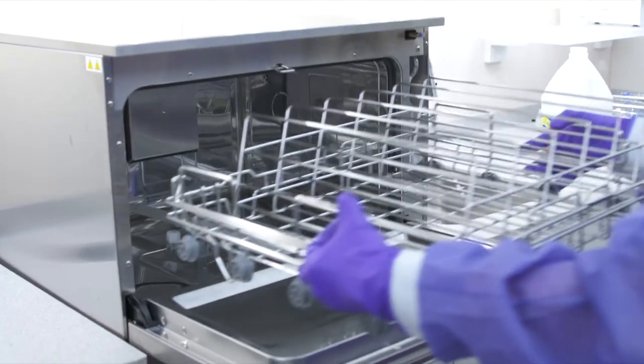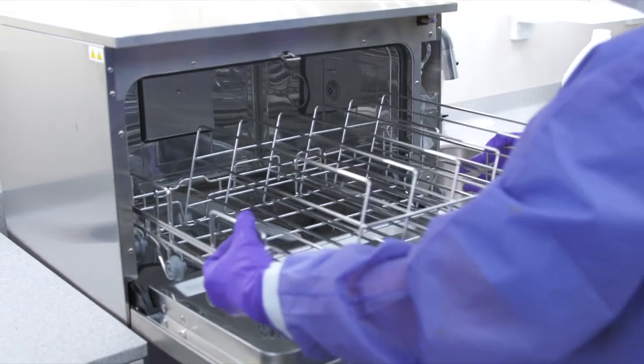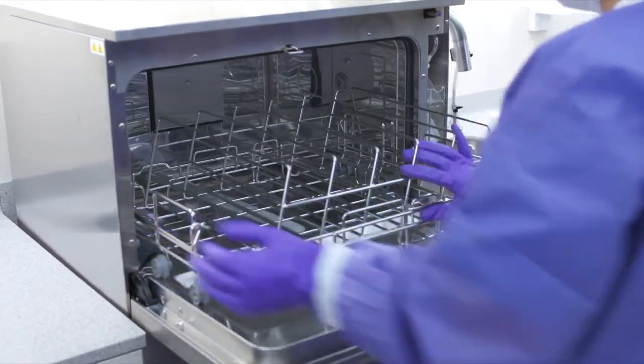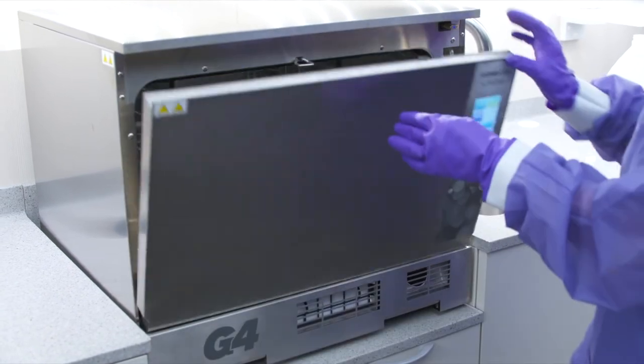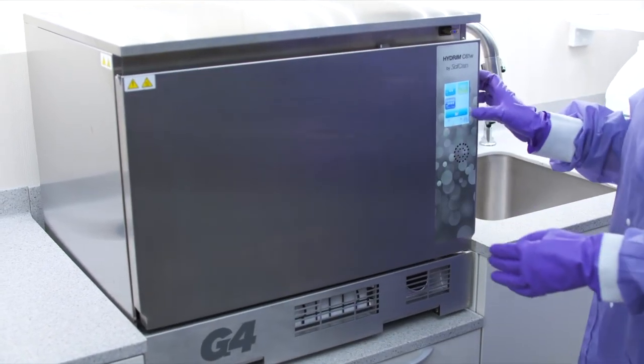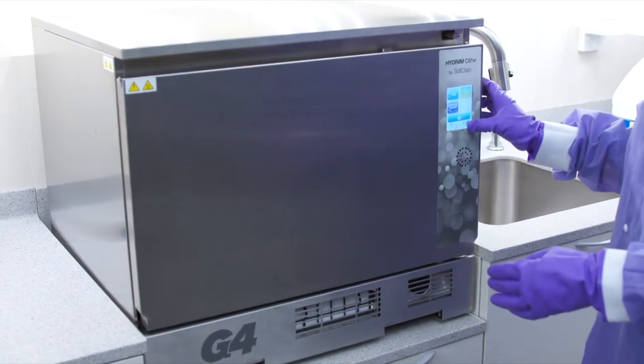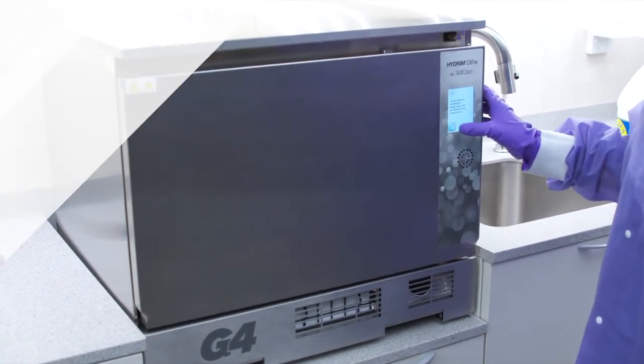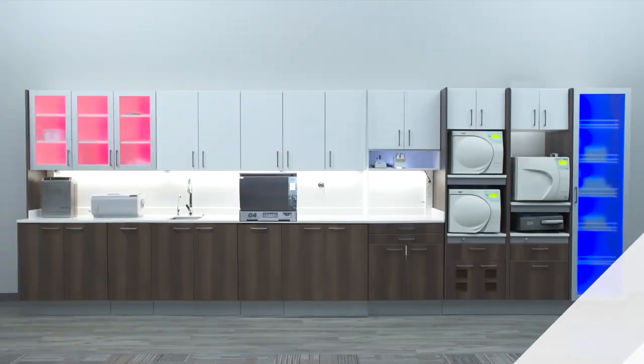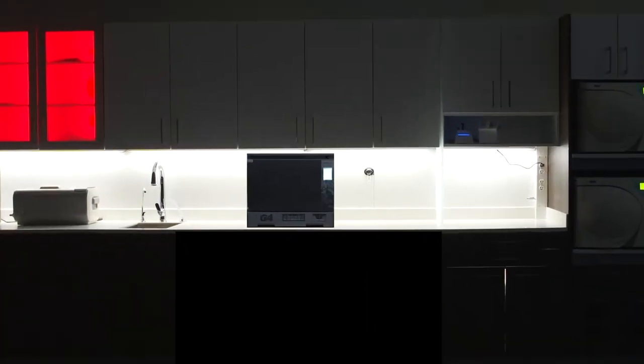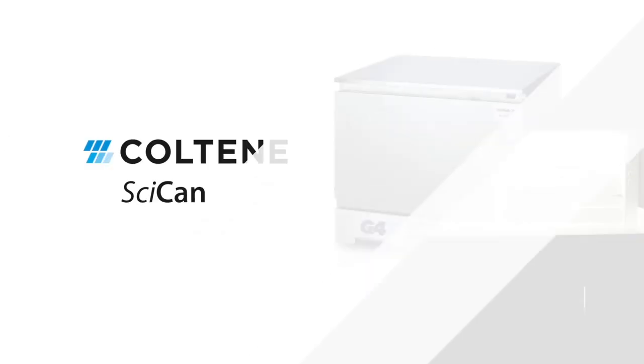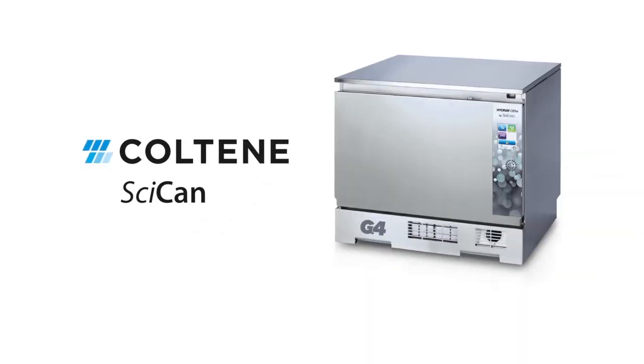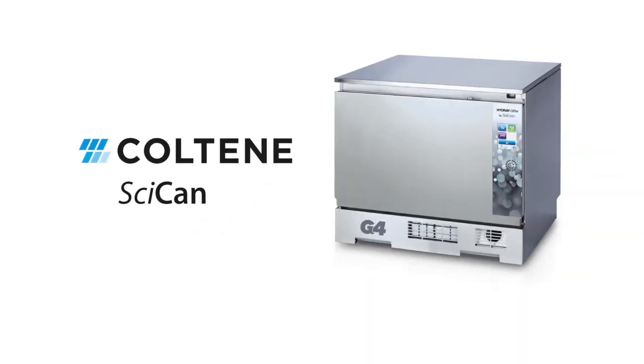You can find more features and options in the operator's manual that make the washing process easy and efficient. Never turn off the Hydrum. Always leave it turned on for additional safety reasons. Thank you again for choosing SICAN as your infection control specialist.